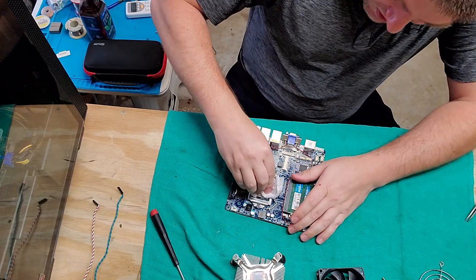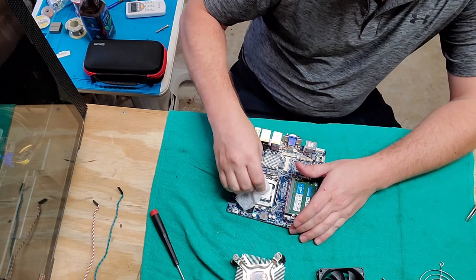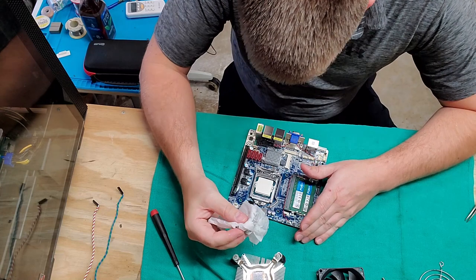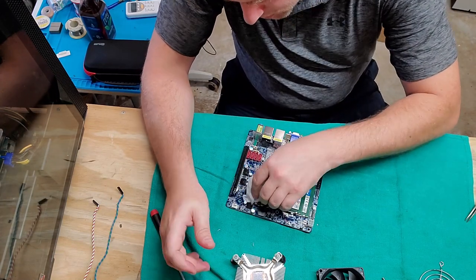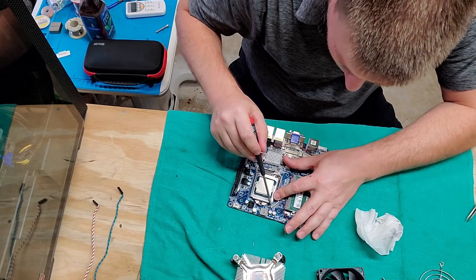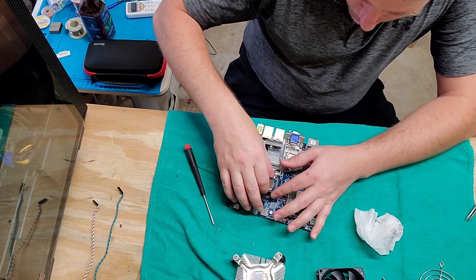Okay, let's see what type of CPU we got on here. Okay. No way. All right. It's better than I thought it was going to be. So I have an Intel Core i3-4330. So it's a 4330 chip. Let's go ahead and open it up. Take a look. There we go. Let's pull it up.